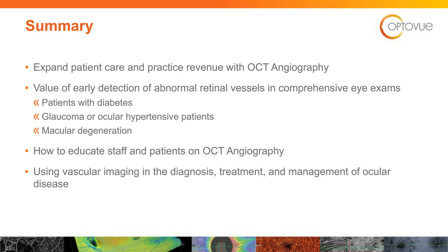I always kind of felt that really wasn't serving that patient to the highest level. Now I believe I flipped that, and I'm even doing more than a fluorescein angiography can do. Because remember, occult membranes are below the RPE, and typically they're not leaking. And even if it's in the retina and not leaking, the fluorescein angiography will not pick it up because it has to be leaking. So really, OCT angiography in the macular degeneration patient has been wonderful.